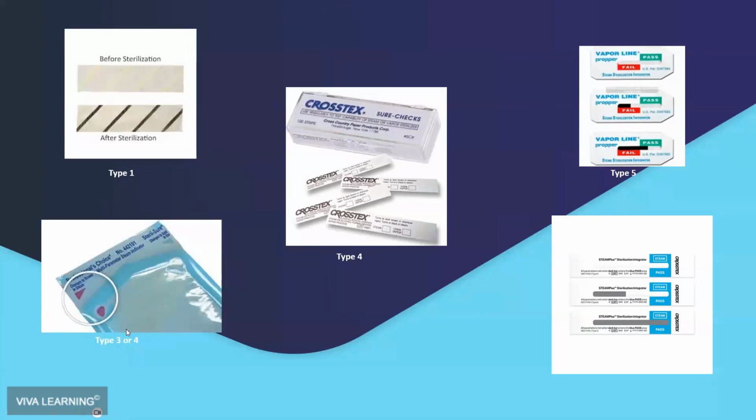Type 3 or type 4, again, external and internal on a pouch. And you, again, have to contact the manufacturer to know which type of indicator, how many parameters they can claim based on FDA clearance for measuring, validating on that particular pouch. Now, these are type 4 indicators that you would place in a cassette or in a pouch that only has a type 1 indicator.